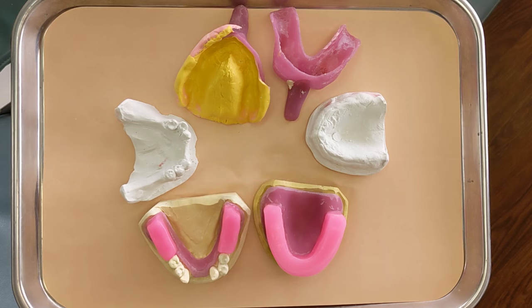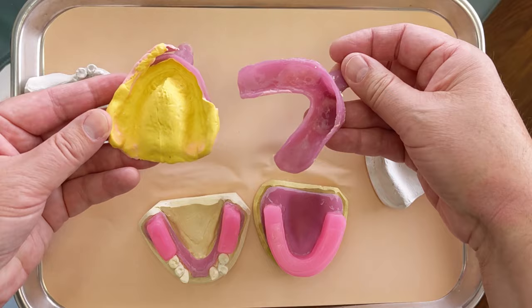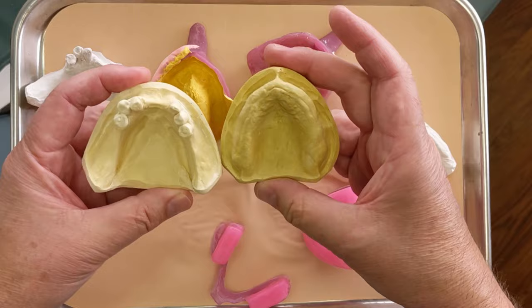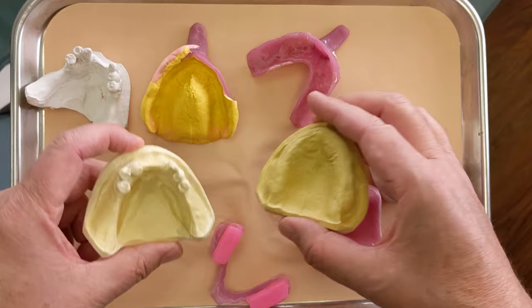Here's a quick summary of where we're at. In part one, we took preliminary impressions to make study models, sent those to the lab, and the lab made us some custom trays. In the last video, I border molded both trays and took the impression, sent those to the lab, and got back the master models with the bite rims. Master models are basically just better quality, more detailed models of the patient's mouth — the actual models that the dentures are going to be made on. Once the dentures are made, these models get destroyed, so they're basically a one-time use.